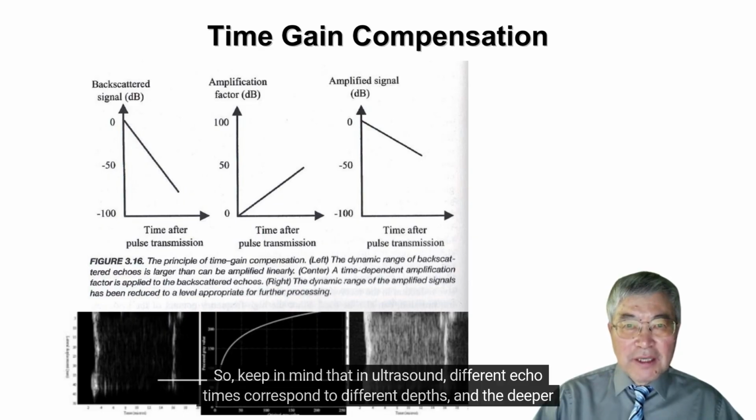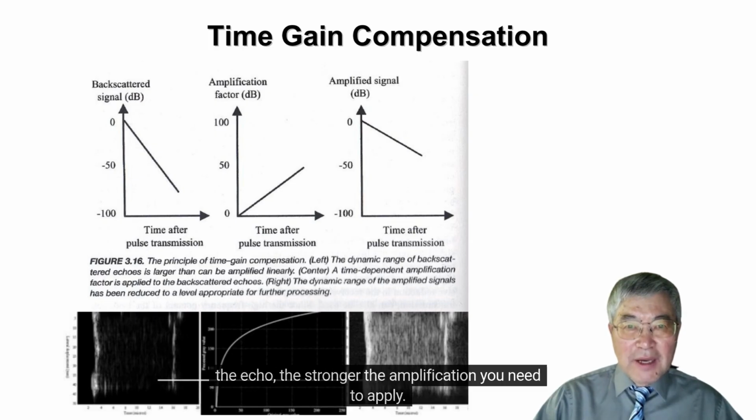So keep in mind that in ultrasound, different echo times correspond to different depths, and the deeper the echo, the stronger the amplification you need to apply. That's the principle of time gain compensation.